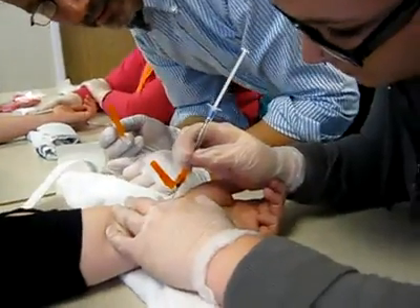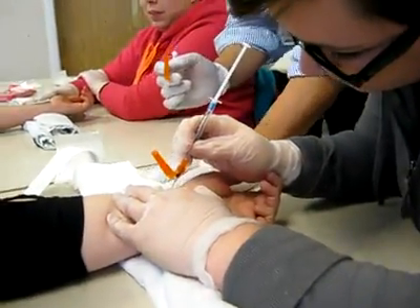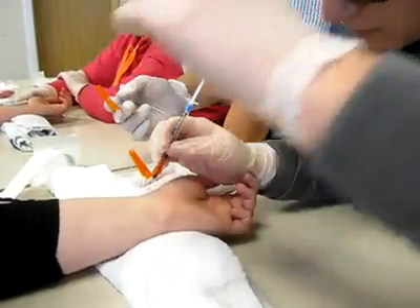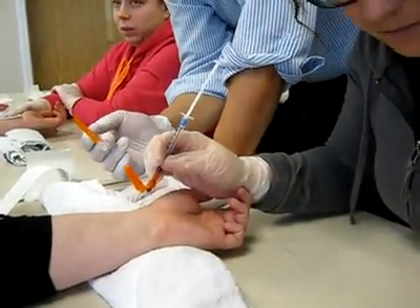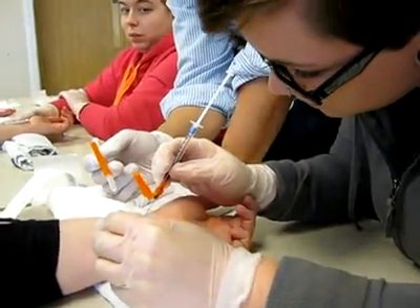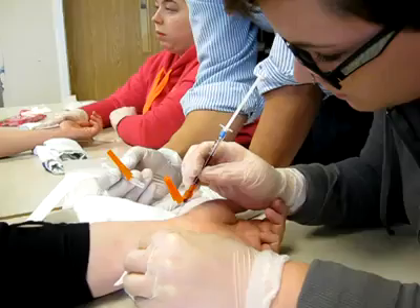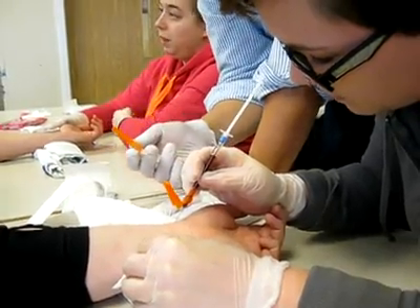You got it. You see it filling? Now stay there. Take your finger off. Just leave the needle where it is. Oh, wow, it's filling so quick. Nice, easy breathing there. So yeah, that's arterial for sure. See how it's pulsing? Yeah. There you go. Boom.